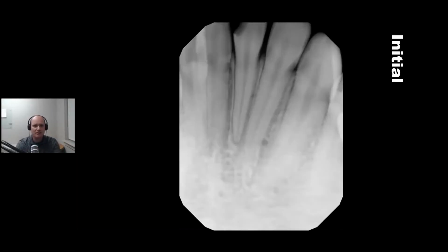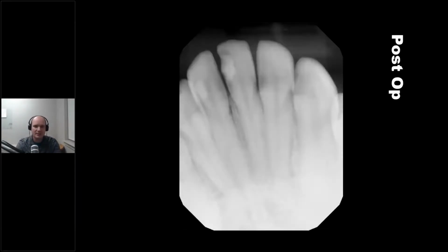Here's another case. Here's the initial visit. This was a 16-year-old with special health care needs, who had a deep lesion on the mandibular anterior. Cooperation got poor. We had nitrous. The kid had done well before, got poor, and we had a pulp exposure. So we disinfected that with sodium hypochlorite. And then I just bulk filled Biodentine in this case because that can last as an interim therapeutic restoration as well as a very good pulp capping agent. And let's give her some time, see her every 3 months.